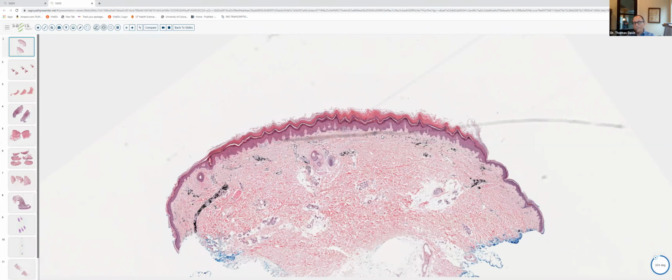And this is kind of an important thing to note. One, you want to make sure that you don't misread those as parasitized histiocytes and raise the possibility of histoplasmosis or some type of infectious process. And two, anytime we look at a re-excisional specimen of something, we as dermatopathologists always look to make sure that we can identify the biopsy site.